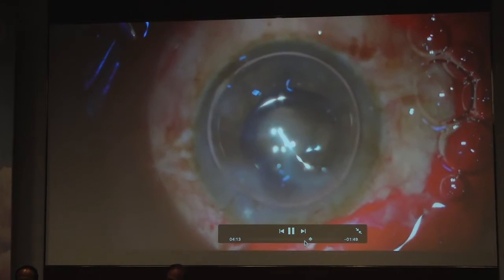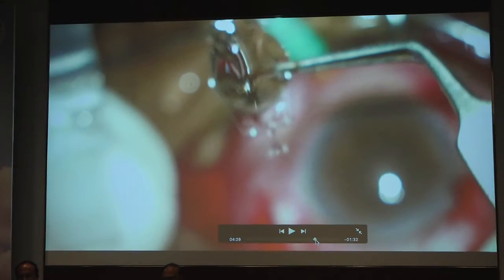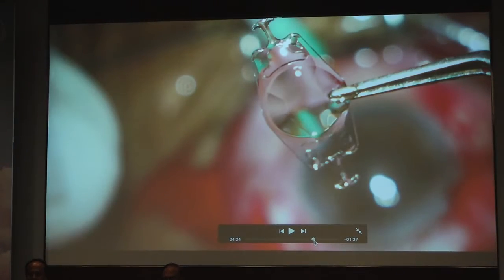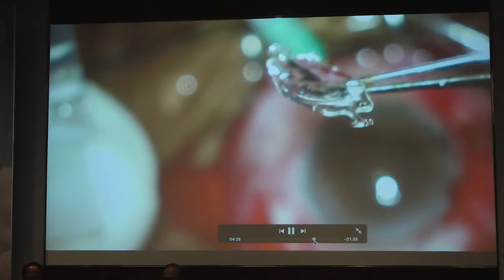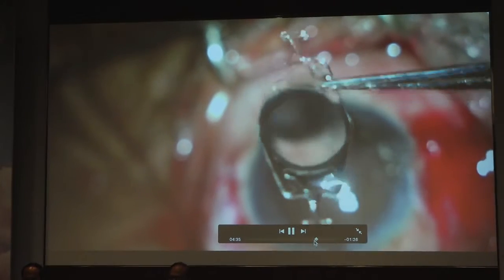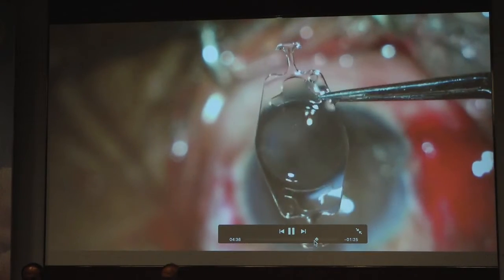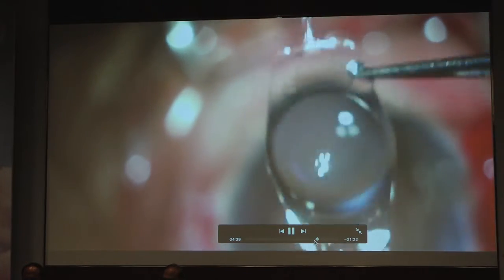The two-step technique is used: the leading haptic is carefully placed inside while visualizing the margins, then through the side port the optic-haptic junction is curved along the iris margin. The Simcoe cannula is used to aspirate remaining viscoelastic.